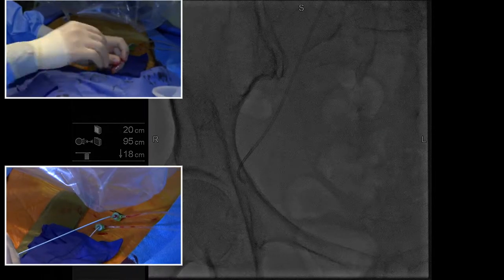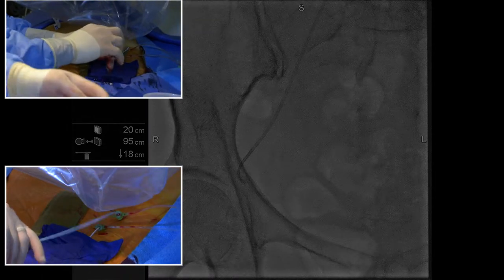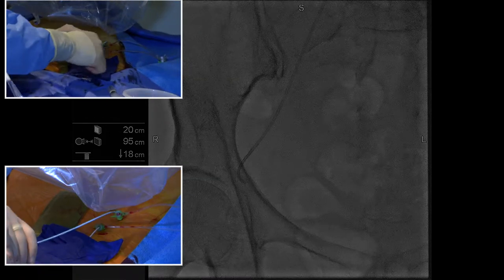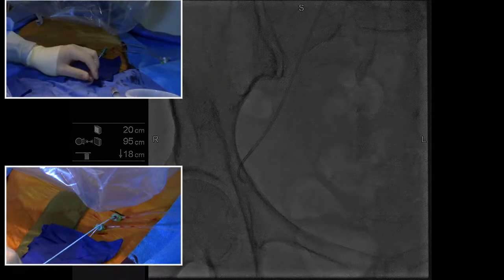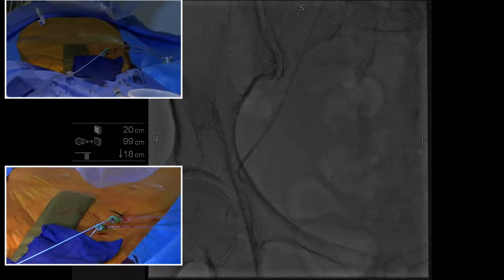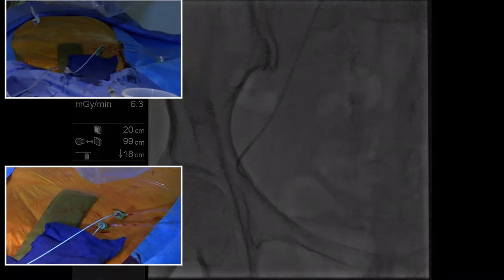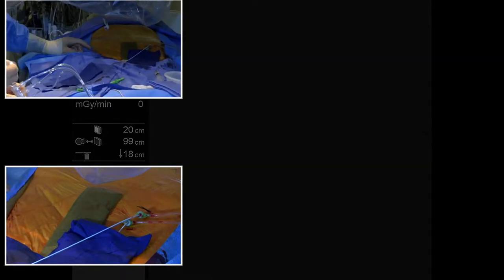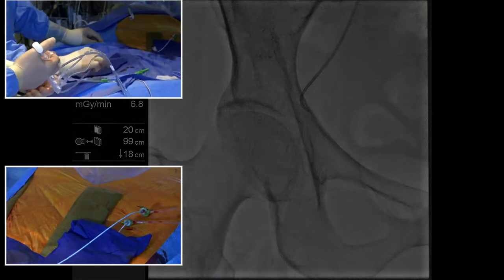Take that wire, please, Matt, thanks. And now we're gonna hook this to our manifold so we can give a little tiny squirt of contrast, not a lot, just a little bit, so we can kind of see where we are. All right, so what we want to visualize is our ideal location of access. So give me a tiny puff there, Ray. Just don't pull on that, there we go.